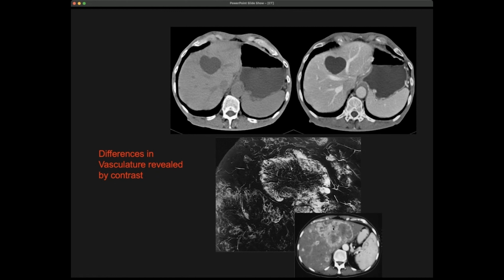While this is another patient, and what you see here is now after contrast, that this lesion captures a lot of contrast. And when you would do a very detailed histology here, this is actually later on a detailed histology, you see here individual blood vessels. So you see there's a huge amount of blood vessels in this structure, and there's nothing in the middle of it. So this is a very, very aggressive tumor.